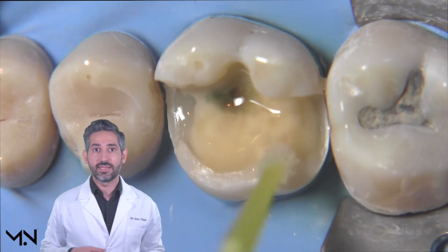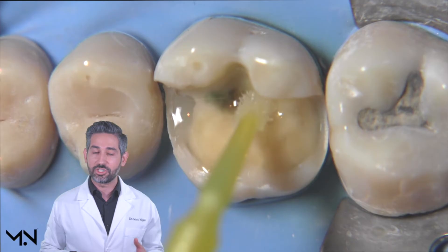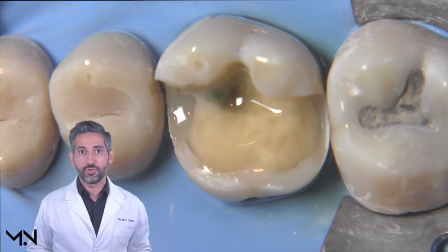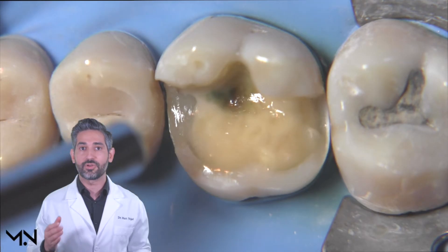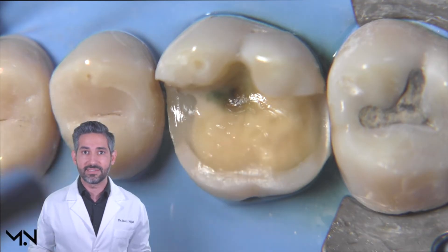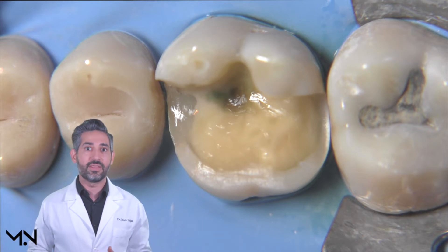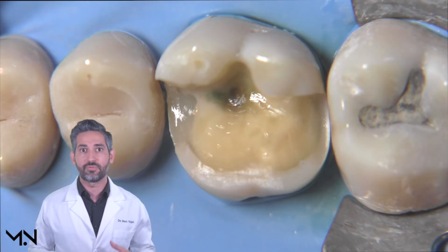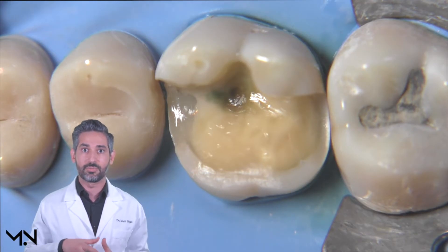In this demonstration I'm using a sixth-generation self-etching primer, so I don't need to etch separately. While I'm scrubbing, I'm both etching and priming the dentin, and it's okay to extend past the DEJ. After applying for 20 seconds, you need to air dry your solvent — it's very important to know the chemistry of the products you're using. This product uses water as a solvent, so I need to air dry for a full 10 seconds to evaporate all the solvent. Leaving water behind would create a huge problem for the developing bond.